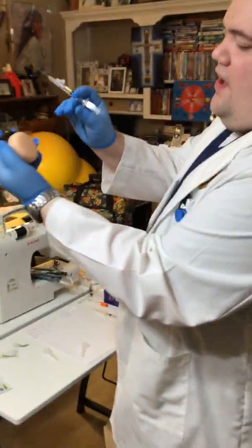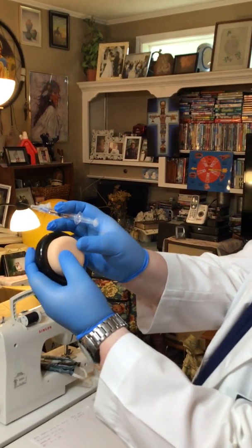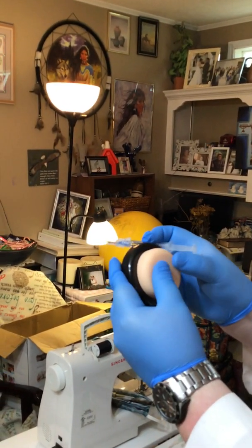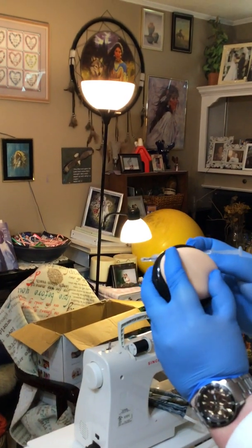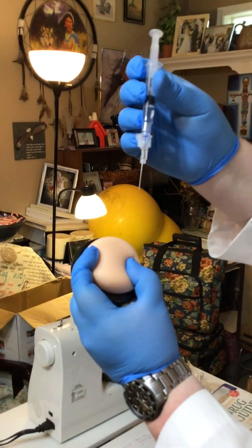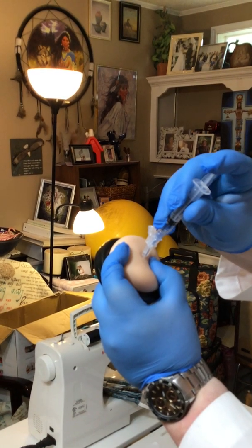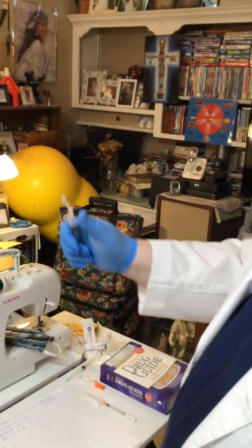I'm going to find his deltoid. When it comes to IM injections, we go opposite of subcutaneous. Subcutaneous, we pinch. But in IM, we want to hold it like this because we don't want any fat. So we're going to hold the skin tight, 90-degree angle, bevel up. We find our bevel, it's up. 1, 2, 3. That's it. Activate our safety device.